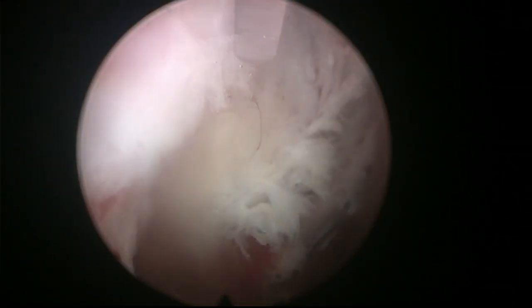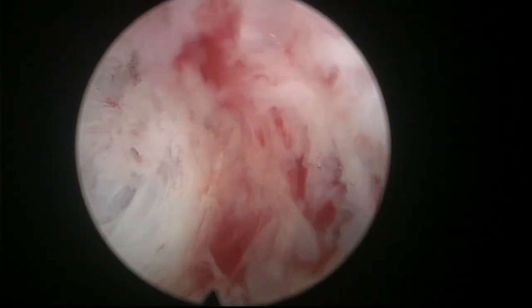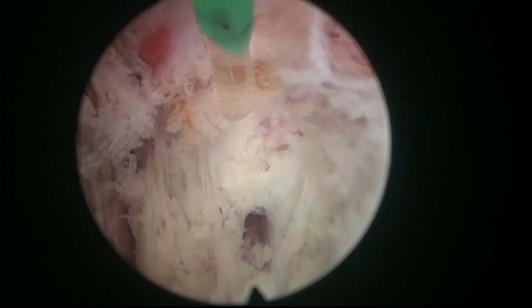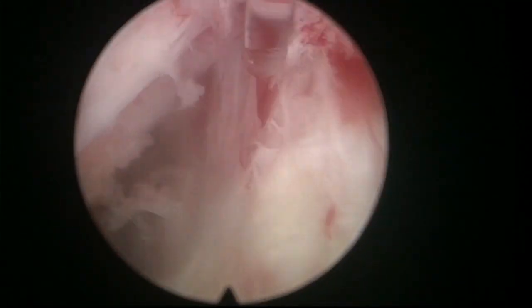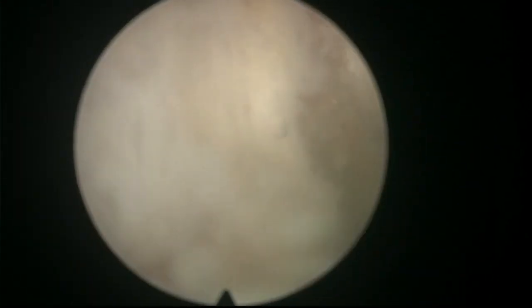And here we come to the apical level, where I want to try to liberate the anterior apex from the sphincter. And of course, try to preserve the sphincter as best as I can. So here I'm going to come up with the fiber, trying to follow the white line. And I will make a cut on the prostate, just trying to detach the apex from the sphincter. And then I will go and look for the good plane. The strategy to do these incisions initially will help me dissect the apical lobe without damaging the sphincter.